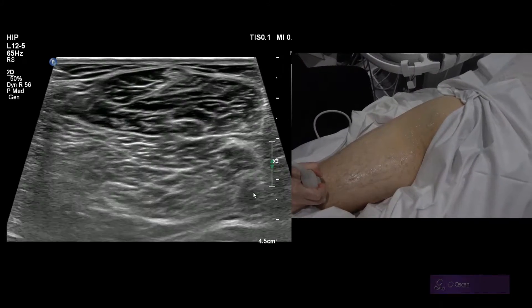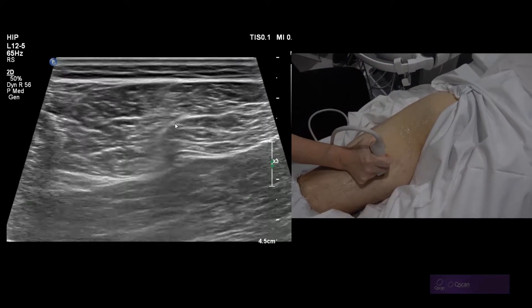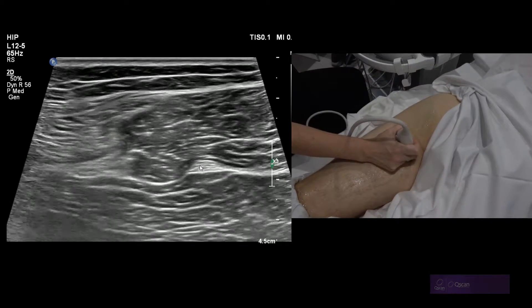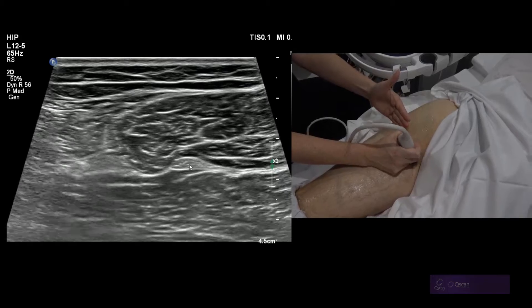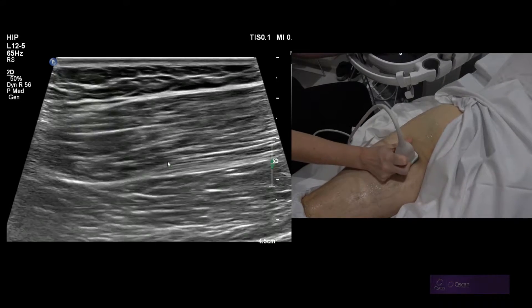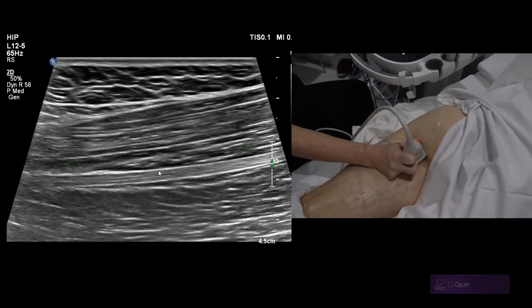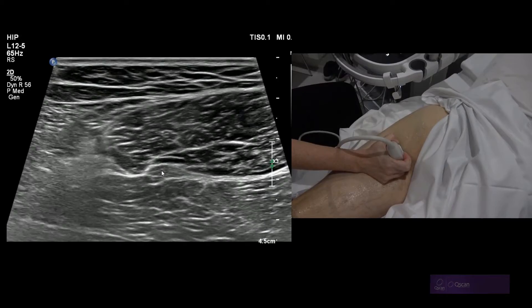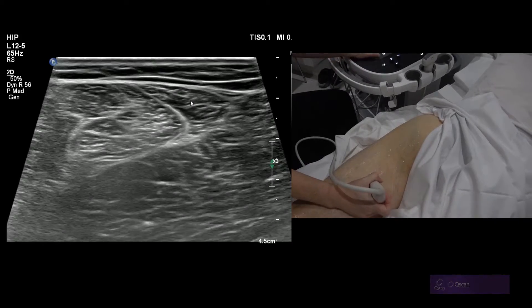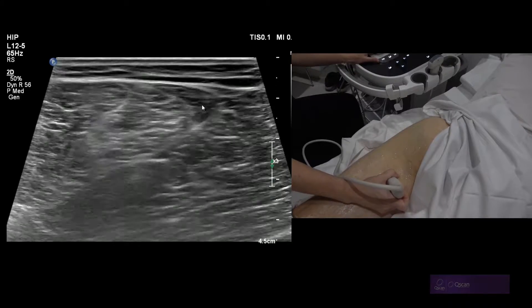The first thing I would do is plonk down here, find semi-tend, and run up until I see that Venetian blind effect, then look beneath it for semi-membranosis. Take a series of images from the gluteal fold, 10 below, 15 below, and compare with the other side, because a lot of tears will affect this little semi-membranosis. If it's thick and hypoechoic, having lost that fibrillary pattern on one side, you know that's a strain injury. You might also have bleed tracking along the aponeurosis, and may or may not have a tear or hemorrhage in the comma-shaped semi-membranosis muscle belly.